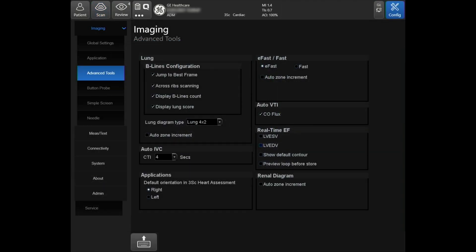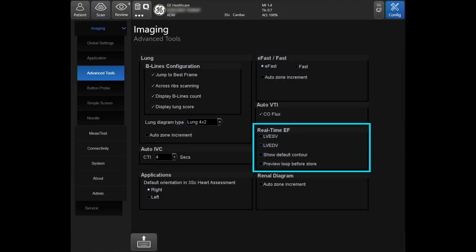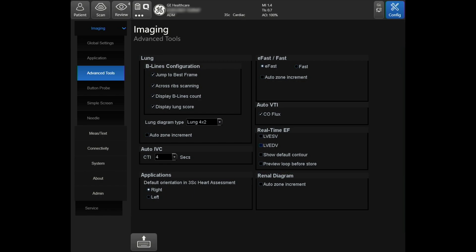Additional measurements that can be calculated include the left ventricular end diastolic volume and left ventricular end systolic volume.